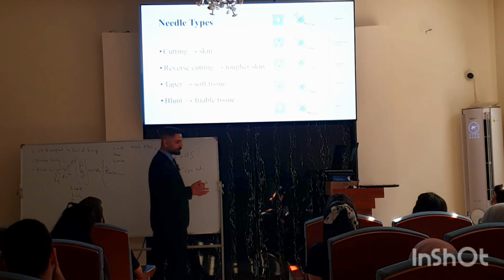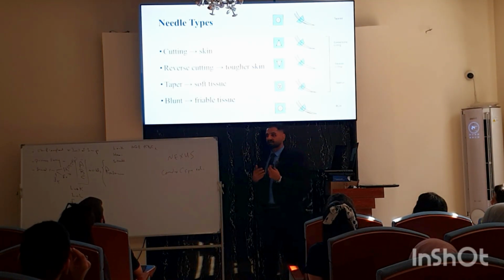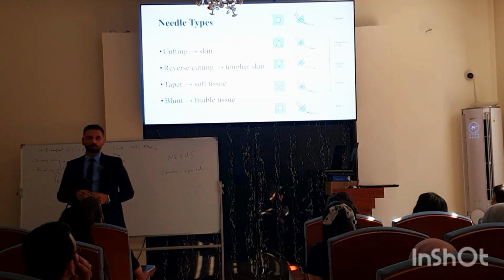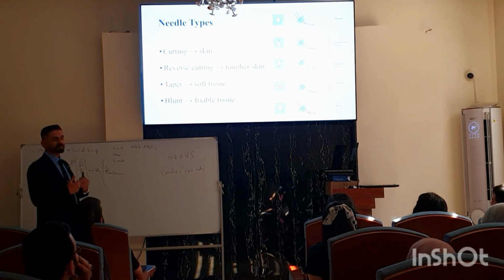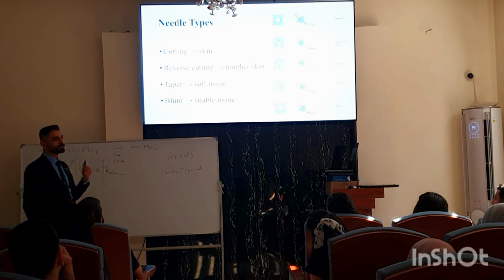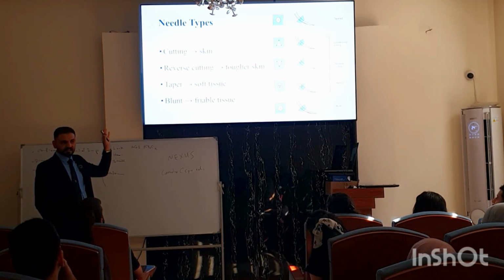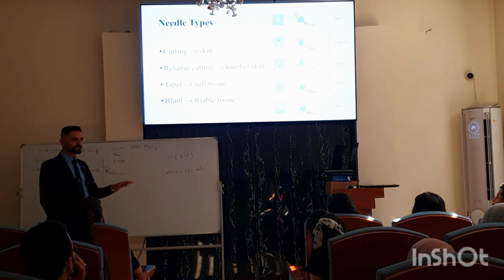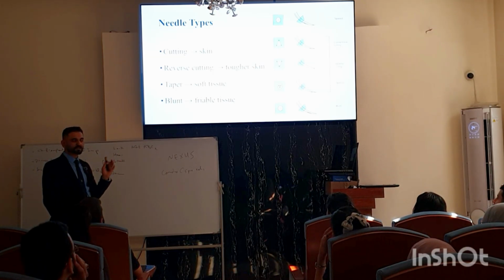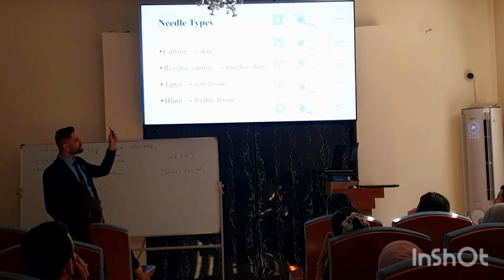When you are the person who's responsible, we say that you are the doctor, you are giving orders, and the others are just following. So you will take the decision. The nurse or the pharmacist will ask you which type of needle do you want, and what should I bring to you. So you should specify. You are the one who specifies. The needle should be chosen according to the tissue you are working on. It's not dependent on the strength of the suture. It's not dependent on the type of the suture. No, it's dependent on the tissue.